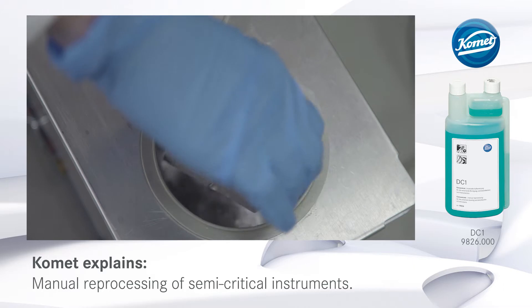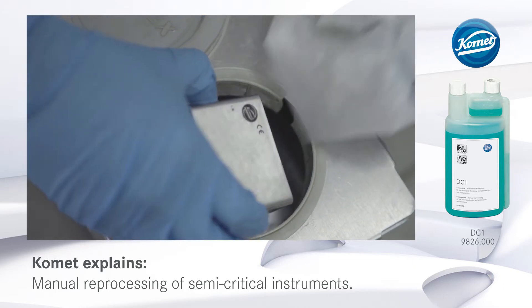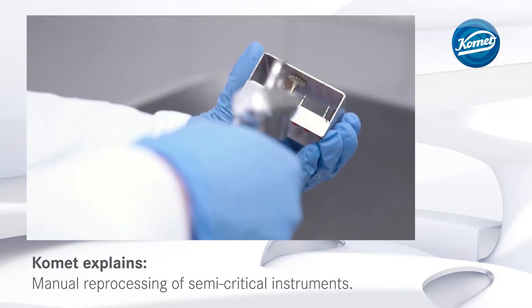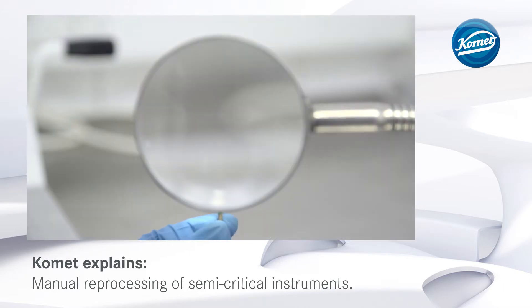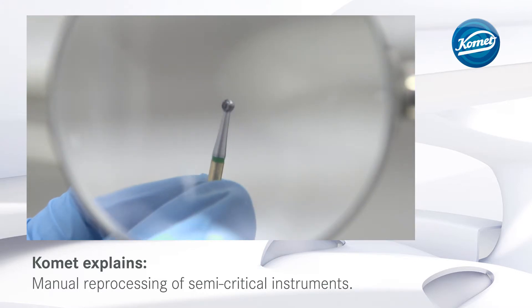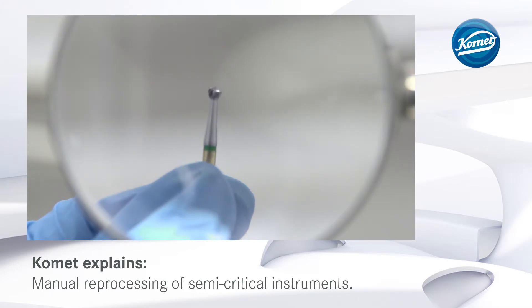After completion of the cycle, the burr block is removed from the ultrasonic bath and rinsed. The instruments are then dried with compressed air. This is followed by a visual inspection with magnifying glasses. Worn instruments have to be discarded.